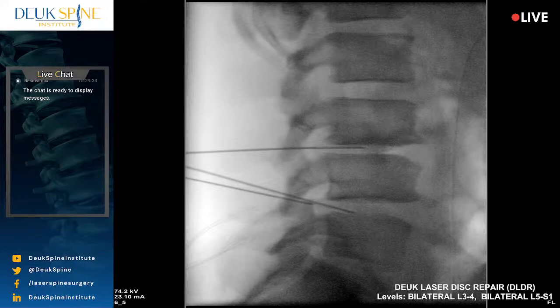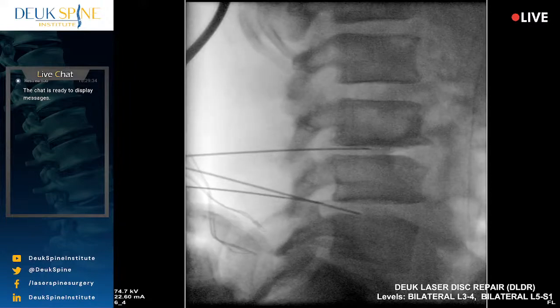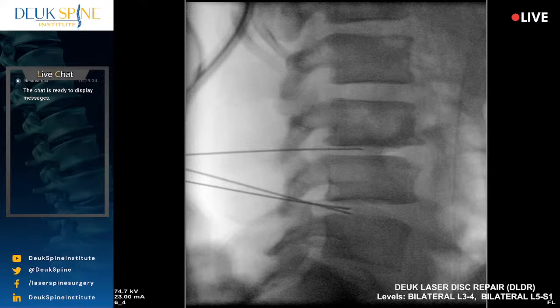You okay? Any pain in your leg? Good. Yep. All right, we're almost done. Then we'll put you to sleep, okay? So, second incision is here on the patient's right flank. So far we've lost maybe 10 drops of blood. So half of a milliliter. You're almost done. Just lay still.